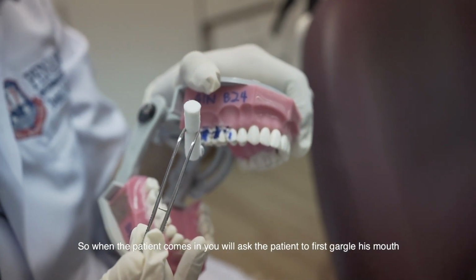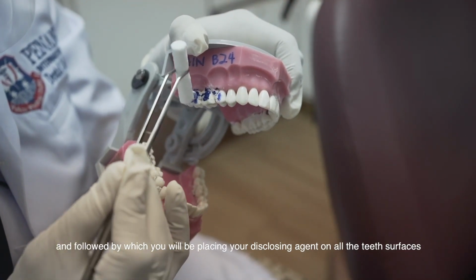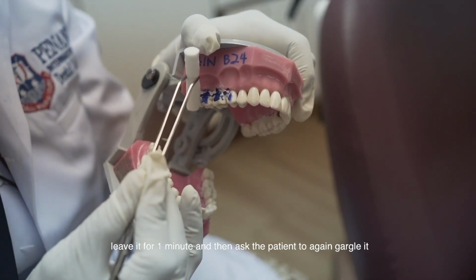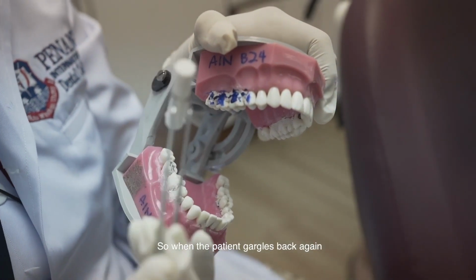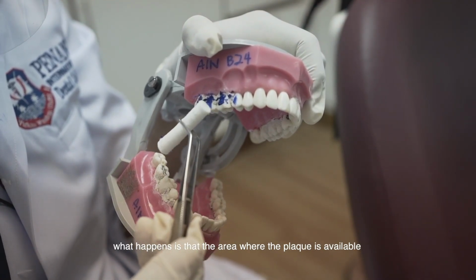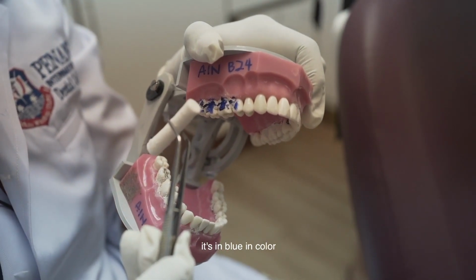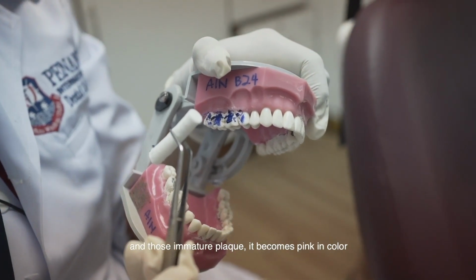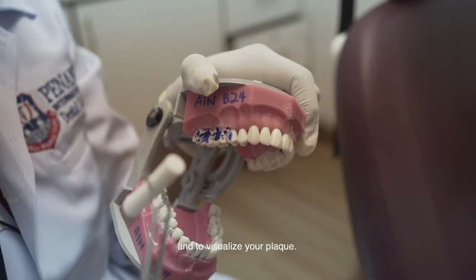When the patient comes in, you will ask the patient to first gargle his mouth, followed by which you will place your disclosing agent on all the tooth surfaces. Once this is done, leave it for 1 minute and then ask the patient to gargle again. When the patient gargles back, only the areas where plaque is available stain: mature plaque is blue in color, and immature plaque becomes pink in color. That is to differentiate your immature and mature plaque and to visualize your plaque.